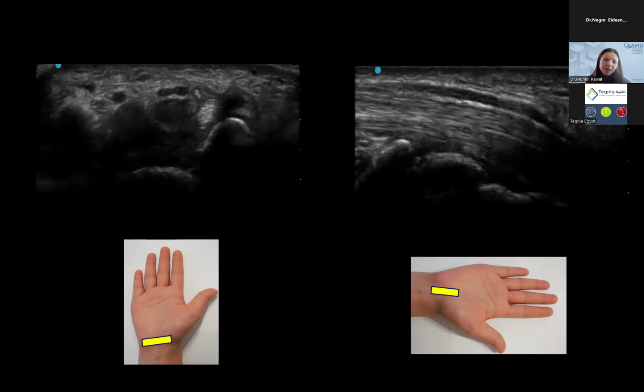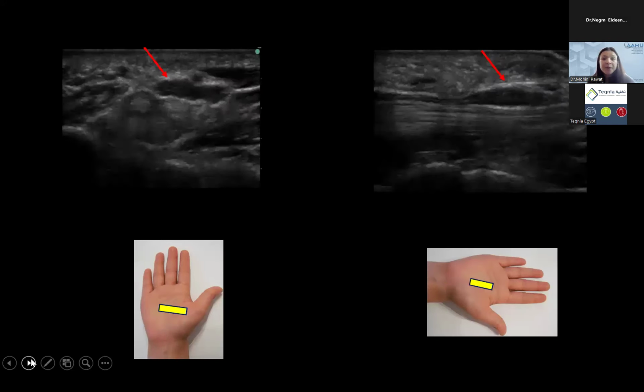I mean, you can say maybe I see something and it is what it is, but when you scan the nerve, you always scan that segment. You don't just stay focused on that typical compression site which we are showing. It's not really showing any significant classic features of carpal tunnel syndrome. So you go a little bit proximal, a little bit distal, so you don't miss anything. In this case, we did go distal. And when you go distal, this is what it showed.